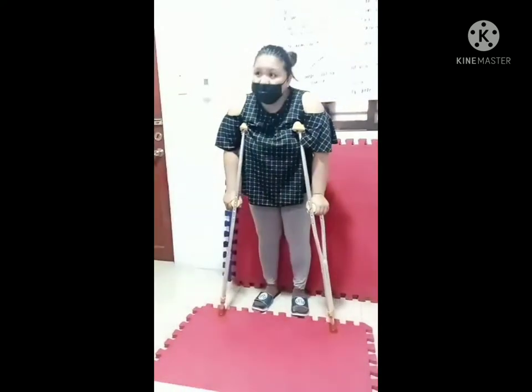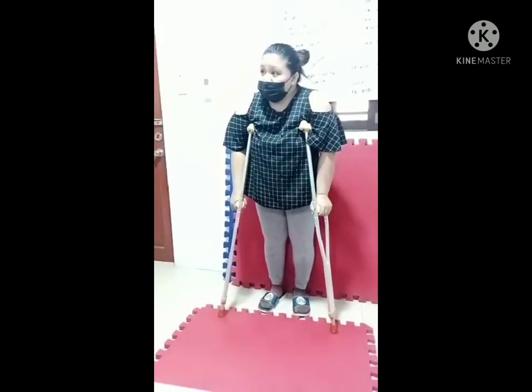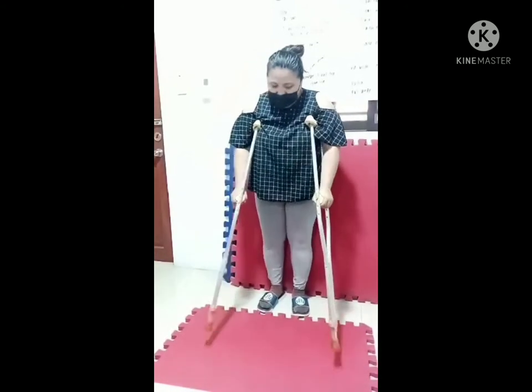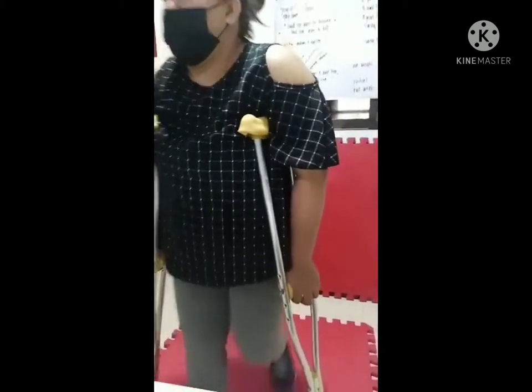We also use swing gaits: swing-to and swing-through. First, we use the partial swing-to, and then the swing-through.